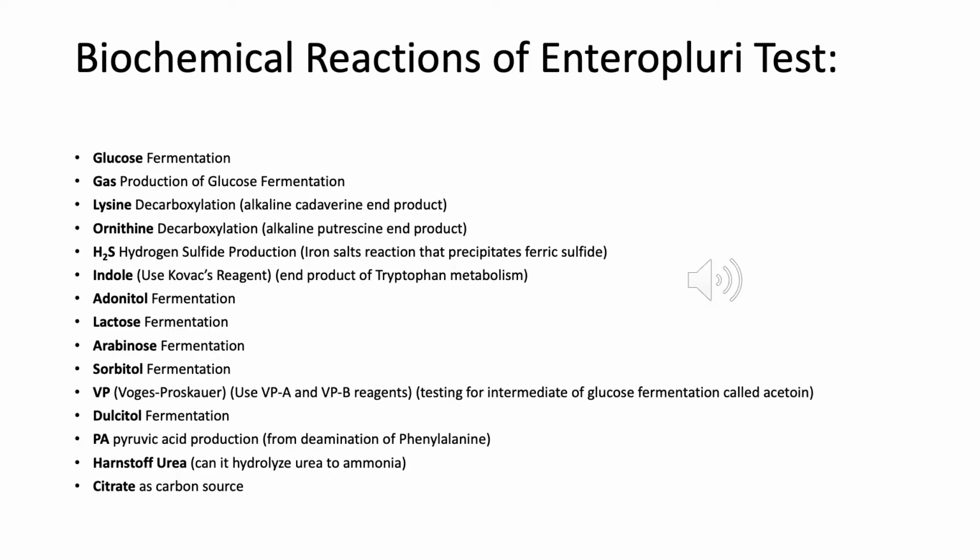This is a list of all the biochemical reactions that are occurring in the Enterotube test. So don't worry, it's not something you would ever need to know all of them or memorize. They would always be given to you, but I just wanted to show you all the different tests that are being tested in this one tube.